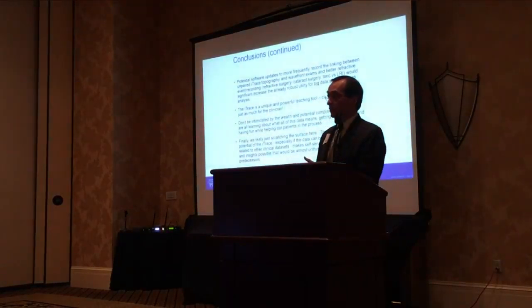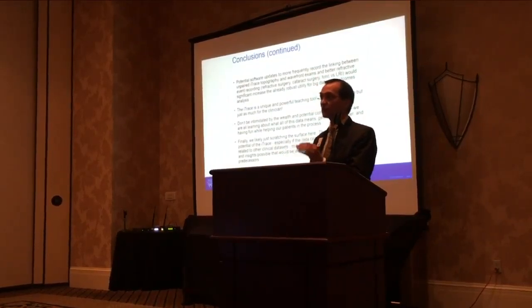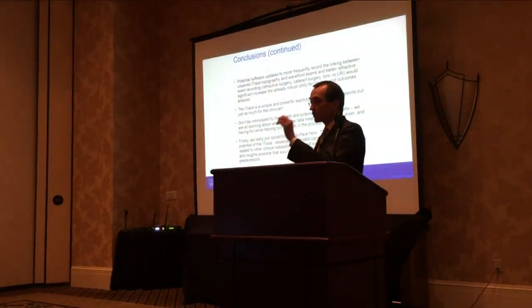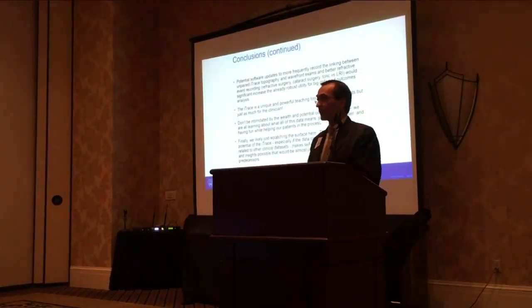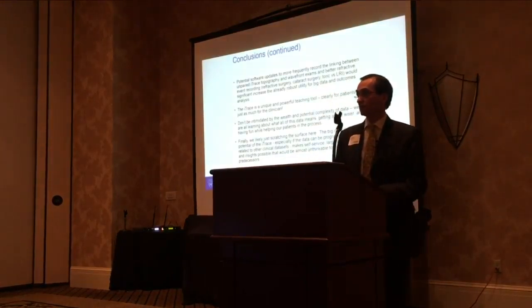I think that's a great question. The only way I always try to think is, how can you do it in an automated way? I don't think you can do that in an automated way. If somebody took the time manually to mark an X on the spot on a post-op iTrace image, you could very easily make that determination and answer that question. Because what you say is very important. This is an estimation of what angle alpha may be, but we don't know if we're getting it right with that kind of corneal proxy measurement or not, but that's the best that we have pre-op and post-op, and if somebody were to do that, I think that would be a great contribution.